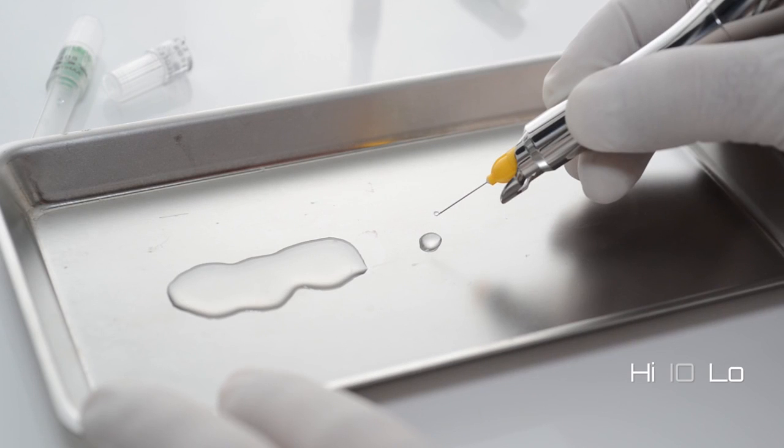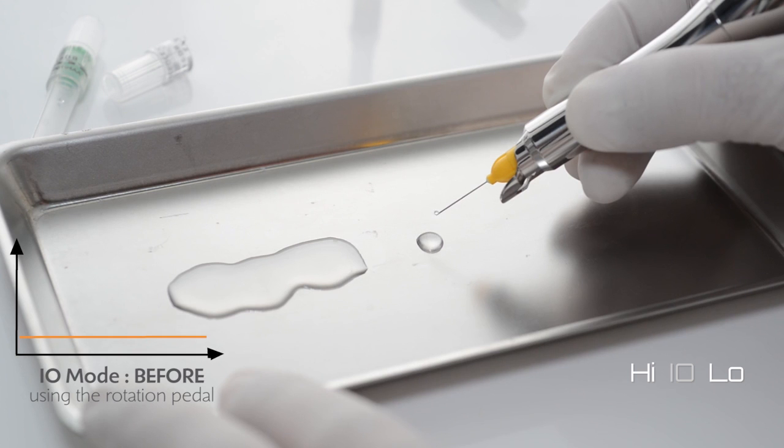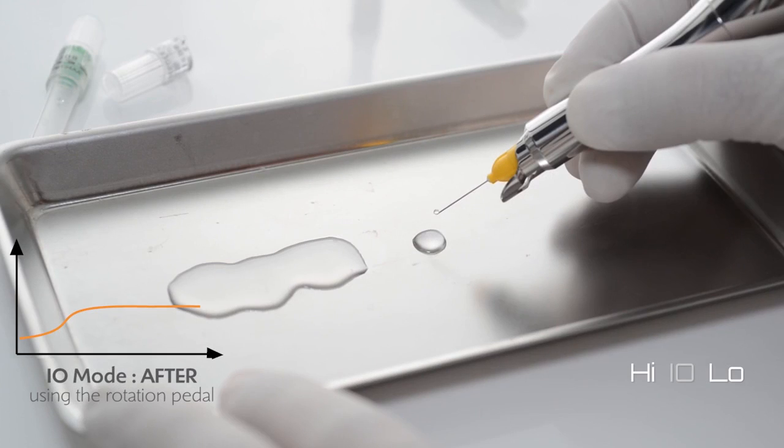In intraosseous mode, QuickSleeper automatically adapts its speed for attached gum anesthesia. The speed is constant. After pressing the needle rotation pedal, QuickSleeper automatically goes into progressive speed to inject into the cancellous bone.